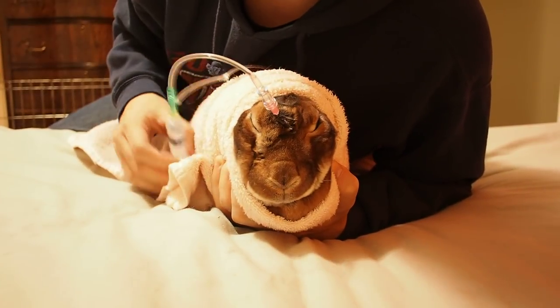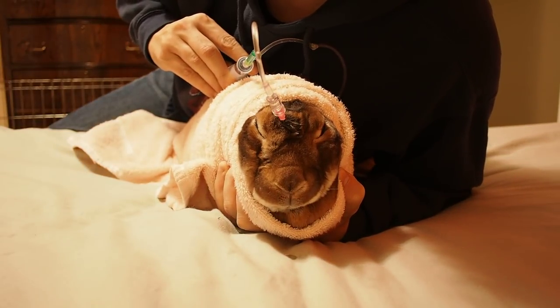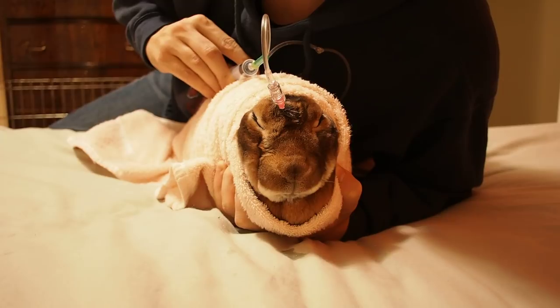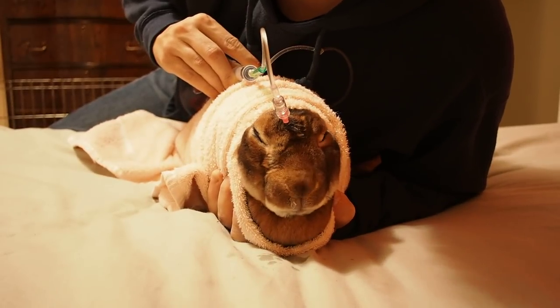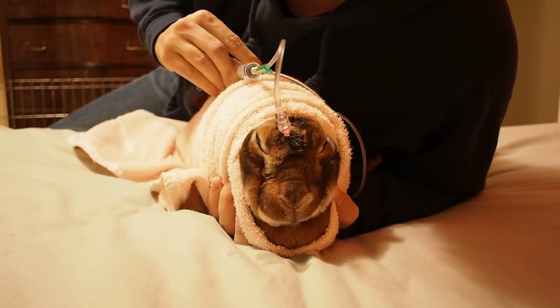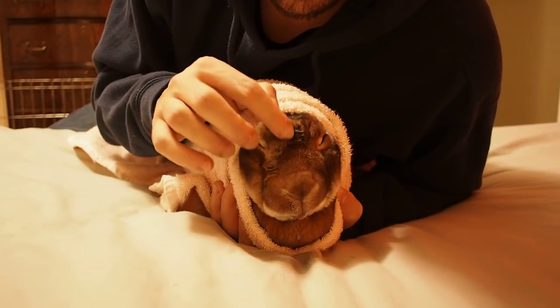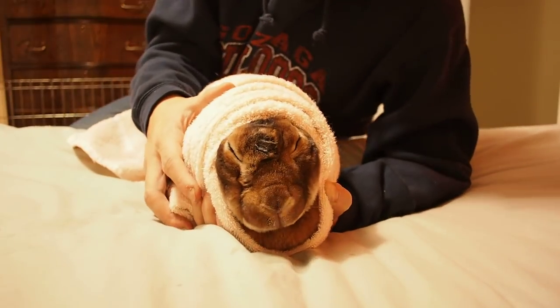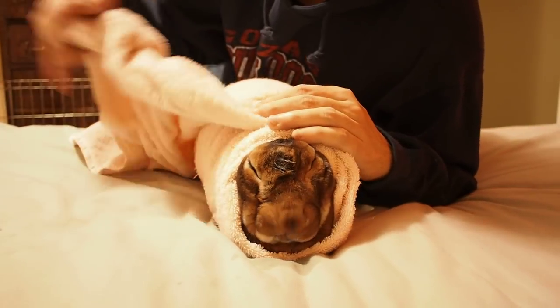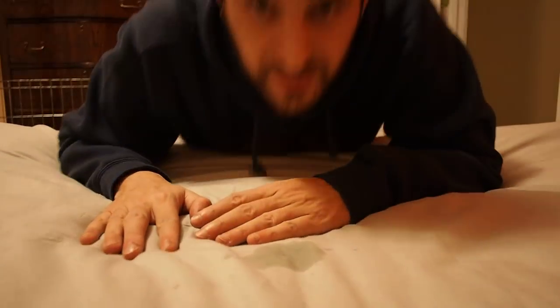And we're in. Once you're in, flush — nice and slow to get a drain. Once it's done, out quickly, a little bit on the edge, rub it in. Then gently put the pressure off. I tend to put her down on the ground after this just so she can get her bearings. And that is how you do a proper gentamicin flush with a portacath on a rabbit.